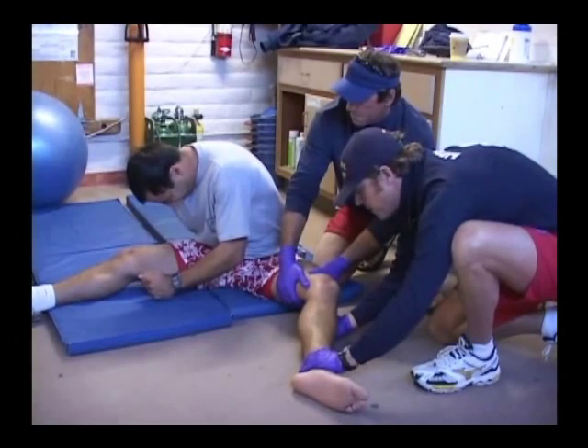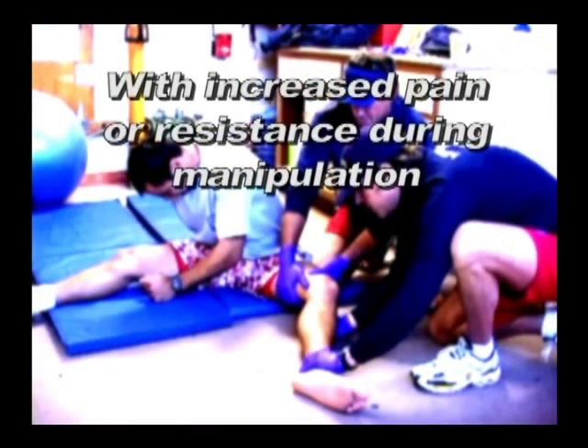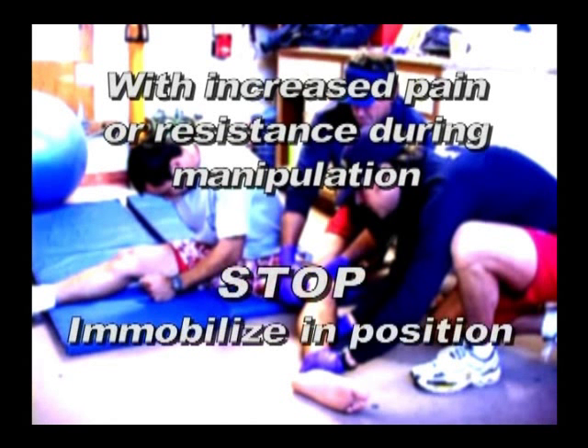If the patient complains of increased pain, or if there is resistance during manipulation, then stop and immobilize the extremity as best as possible in the position found.